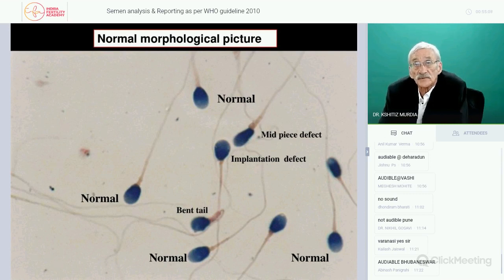This one, you don't have to be educated to understand the sperm is abnormal because of the head shape. The acrosome is small, and the mid-piece is attached on the side of the sperm. So this sperm might be swimming, but it will go in circles because the tail is pushing it in one direction. So you will pick this up in your motility evaluation.